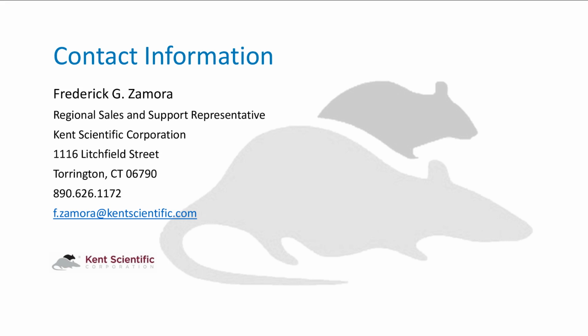We do have a new question that's come in. The question is, have you seen variability in different animal strains like C57 and DBA2Js? Oh, that's a good question. DBAs, I miss those. Anyway, sorry. Have you seen variability in different animal strains?